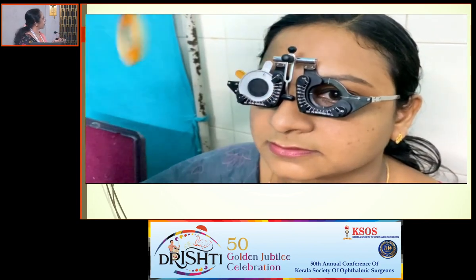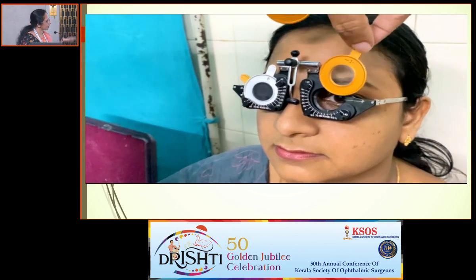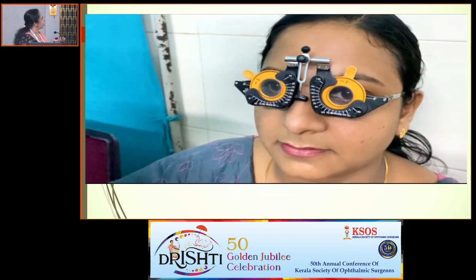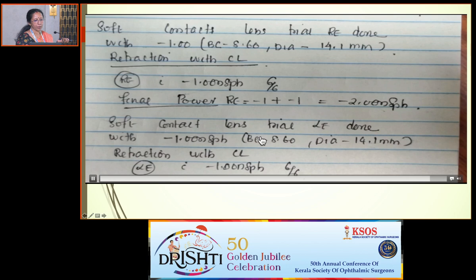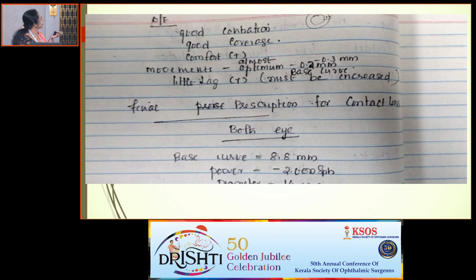Now this is over refraction being done because it was a trial lens with -1 diopter and the refraction was -2. If it's the same power that you are using, you don't have to do an over refraction, but here the over refraction is done with the -1 contact lens and -1 is the over refraction. And this is the final prescription which has to go. See, there is a good centration, good coverage, the patient is comfortable, optimum movements. Since there is a little more lag, the base curve has to be increased. The final prescription should also be given when you are dispensing the contact lens.